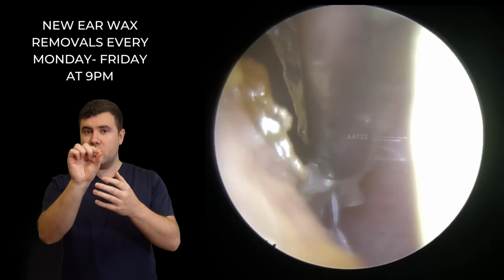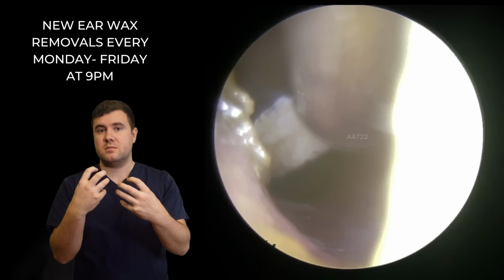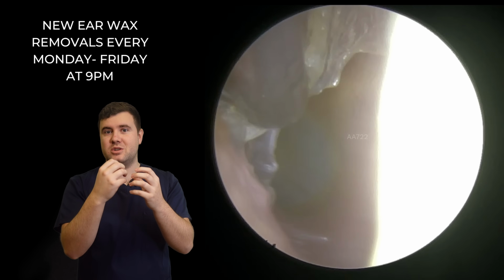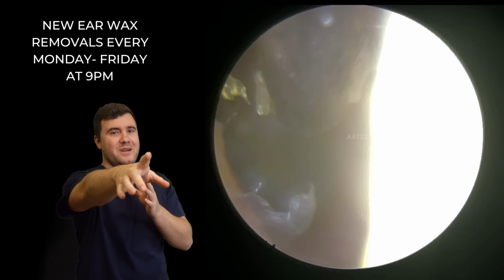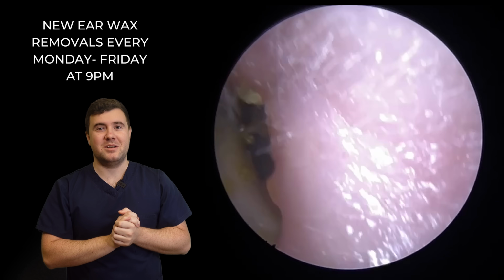So again, we're just holding on to the skin at this point. We're using the force of the suction, which is not very strong, but we're using the force of that suction to actually just pull this naturally. Sorry guys, I've just knocked a bit of wax and it's all on the camera there, sorry. There we go, we clean that off.